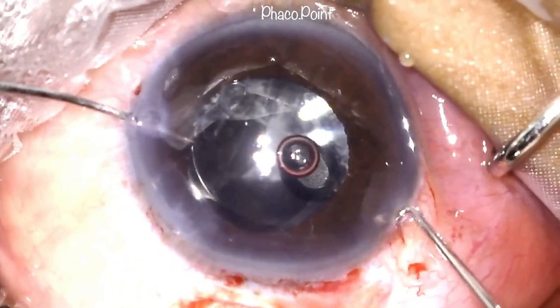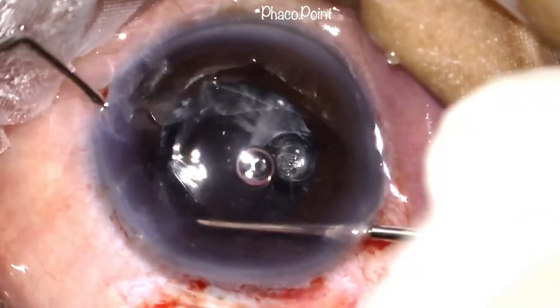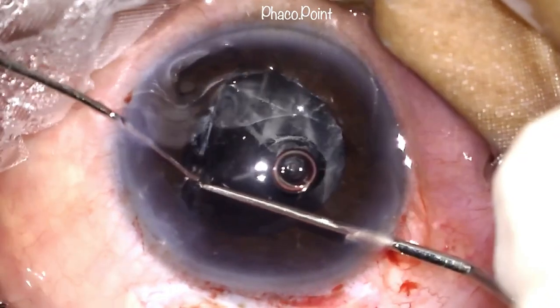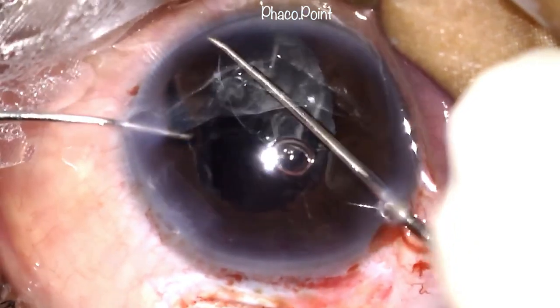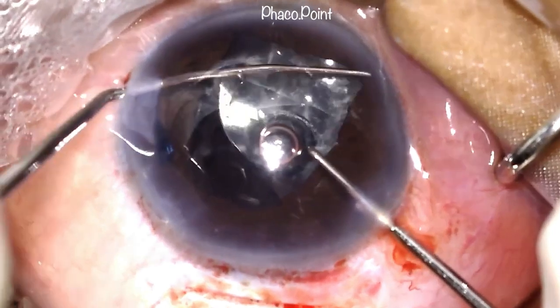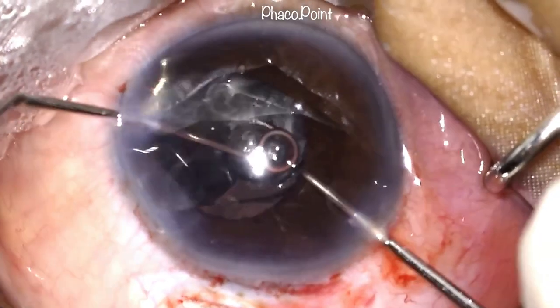Once the tunnel is created, with the help of two Sinskey hooks, the IOL is negotiated and brought out into the anterior chamber, after which it is held via the scleral tunnel created with the help of a McPherson's and brought out of the eye.